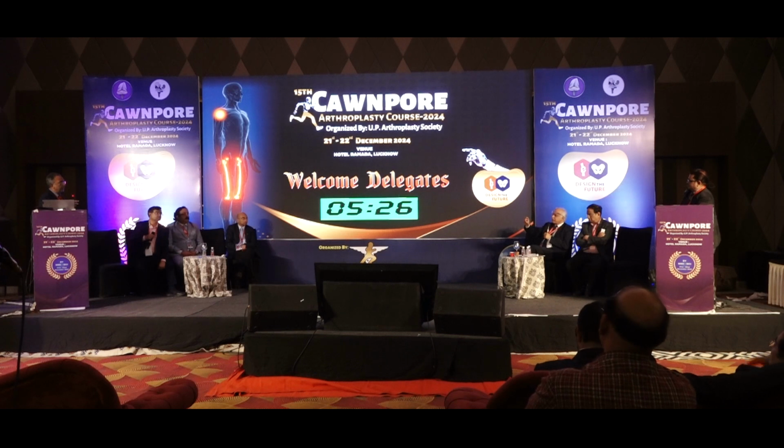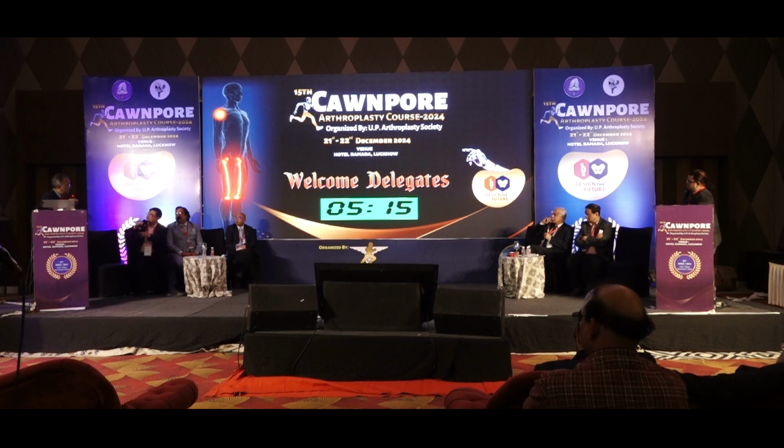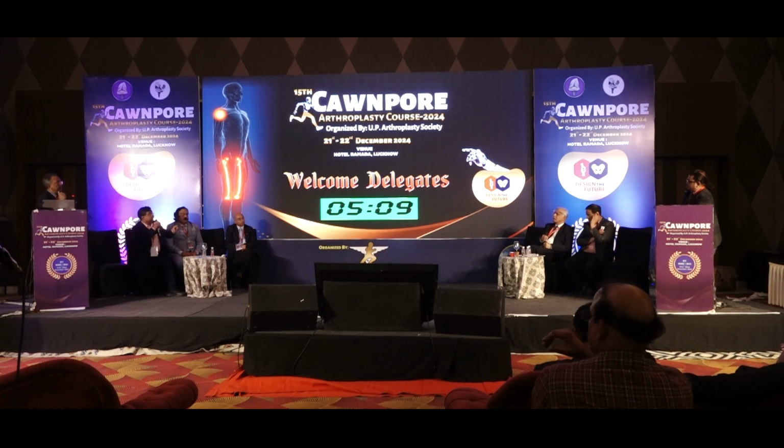So after putting the femur, you put a tibial trial. Yes, trial, and then accordingly fabricate the tibial spacer. Is this the Heraeus system you're talking about? Yeah, the Heraeus system, this is the Copal system. Yes, it's very similar. The femur comes in 3 sizes: small, medium, large, so you can more or less fit it reasonably accurately. In females, you put small. In males, you can put medium or large.